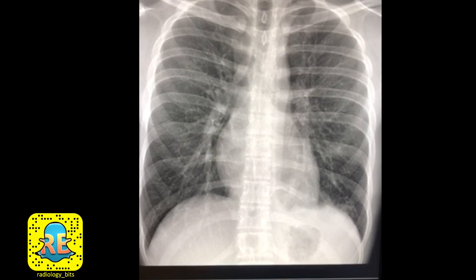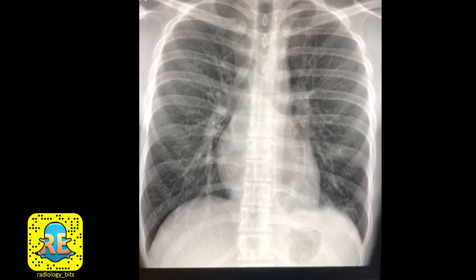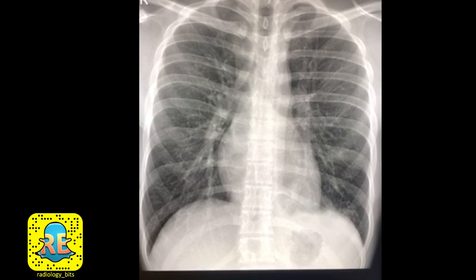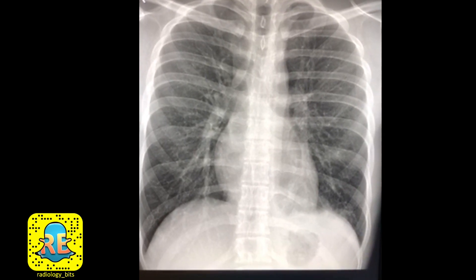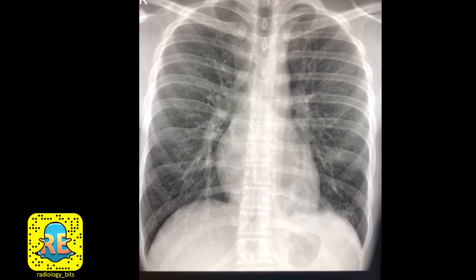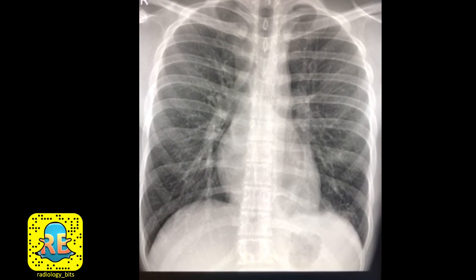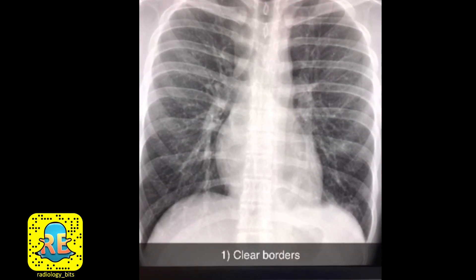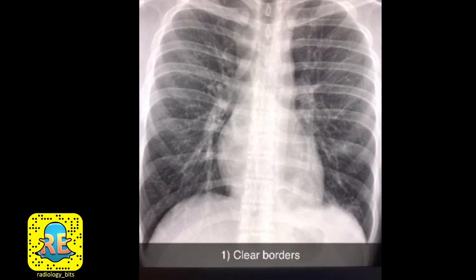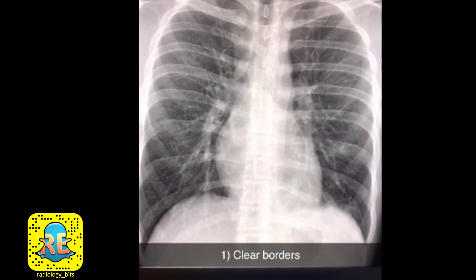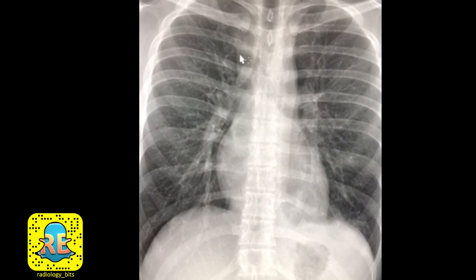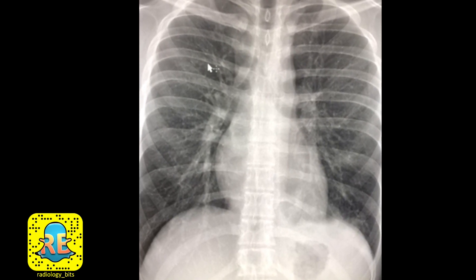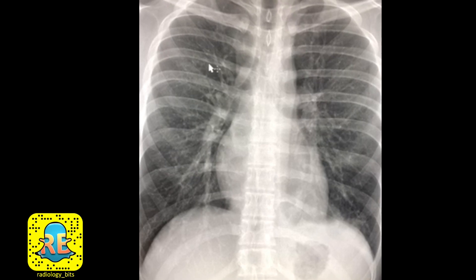In many cases the consolidation or the white opacity related to pneumonia is clear, but in others such as this it might be a bit difficult. If basics are applied correctly, such difficult cases are usually not missed. So let's start with basic concept number one: the borders on chest radiographs should be very clear. If you have two different densities of two adjacent structures, you should see a clear border.